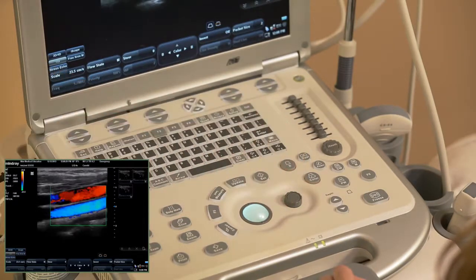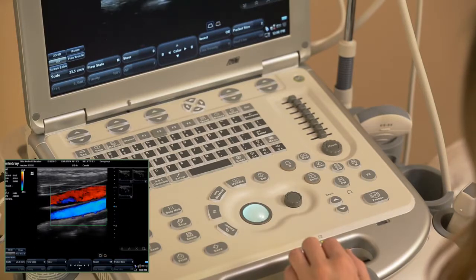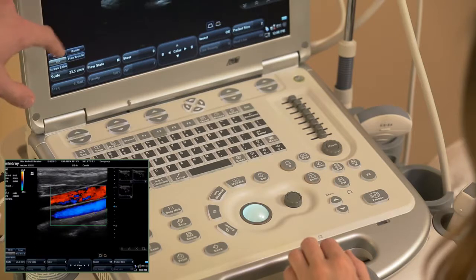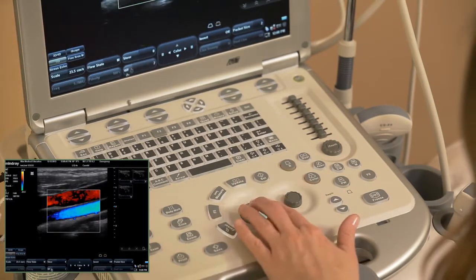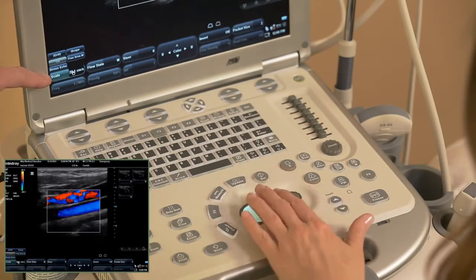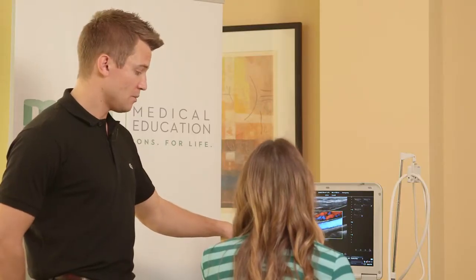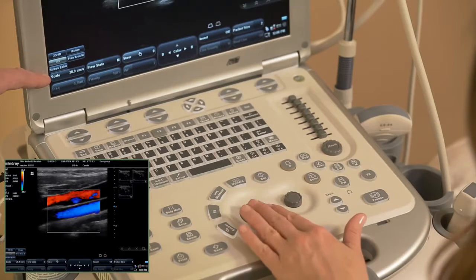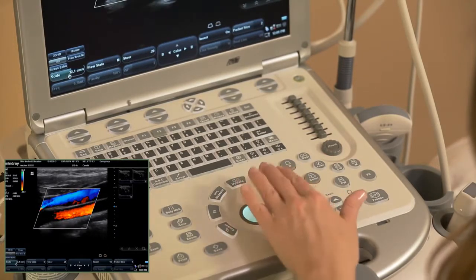So let's talk about scale and inverting the color box and all of the little nifty things we could do. Yep, so when we look at the soft keys again, that's where we have the ability to change our scale and our flow state and our steer. There are various things that go along with these modes that we'll talk about. And so for color, you want to make sure that you have an accurate scale level, so that if you're dealing with a vessel that has fast flow or slow flow, it'll allow you to manipulate that scale in order to accommodate that vessel and have the optimal image that you'd want to have on there.